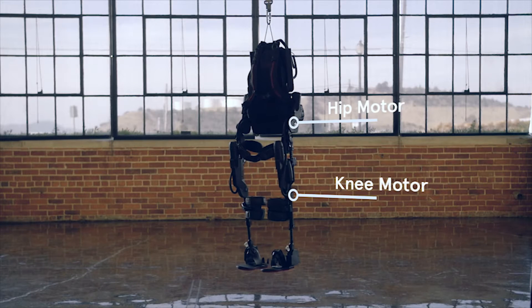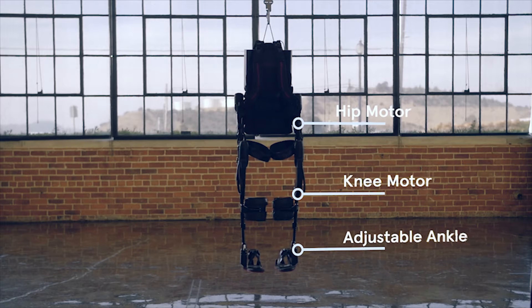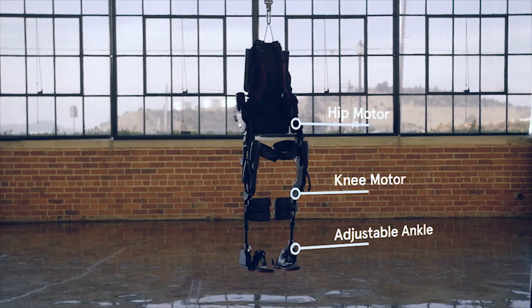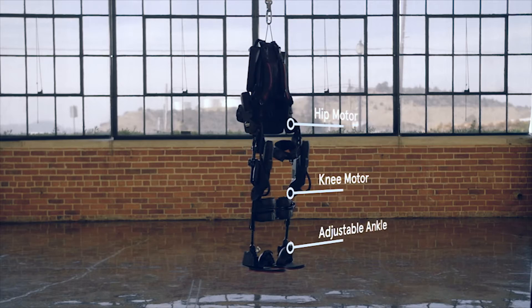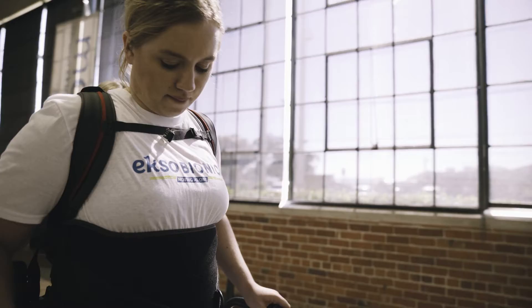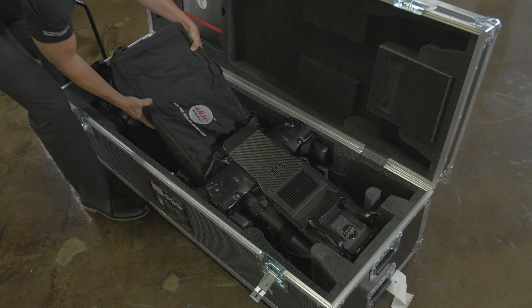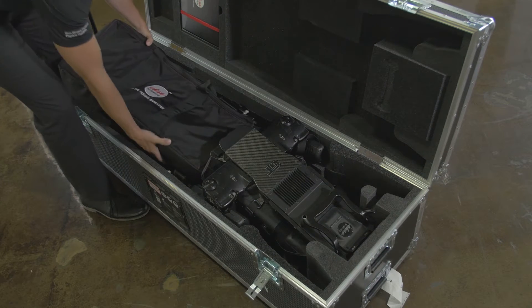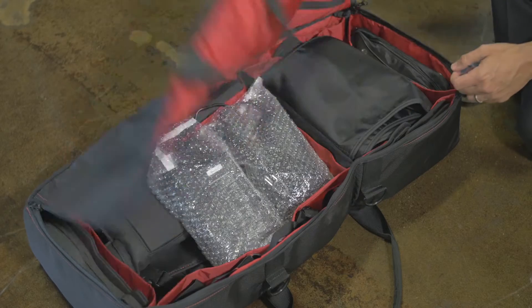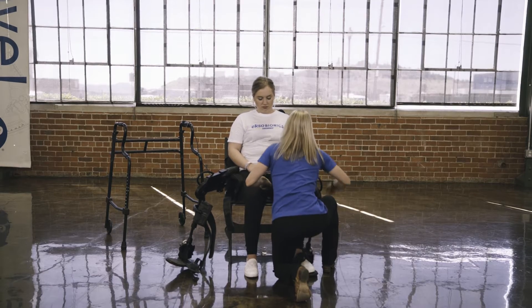The EXO-GT has two motors at the hips and two motors at the knees. The ankles are not powered, but are adjustable to assist with balancing the EXO. The device is self-supporting, and therefore the individual using EXO does not feel the weight of the device and is fully bearing their own weight within the device. EXO-GT comes with a fit kit containing pads and spacers to allow customization for individuals of all shapes and sizes.